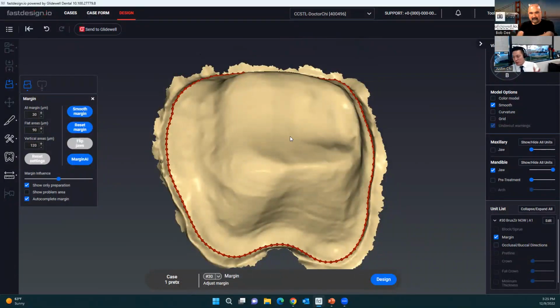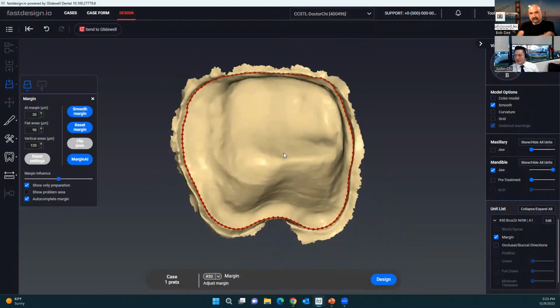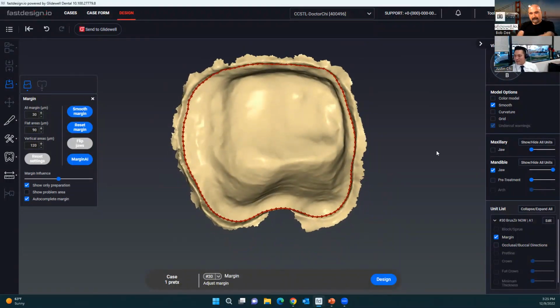There are a lot of different tools, and I really just want to show you the workflow, a simple process. But I'm glad you're showing some of those tools you learned about to aid with marking the margin, because as we know, it's so important. We really want to get that dialed in as best as we can. Right. All right, well, thanks for that.